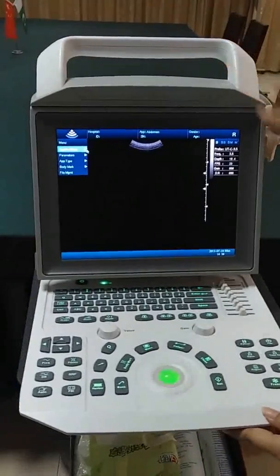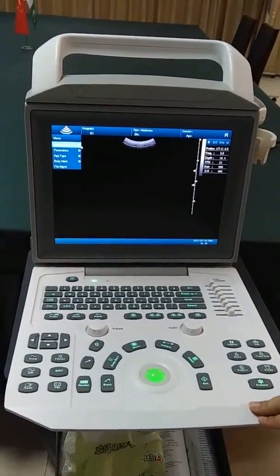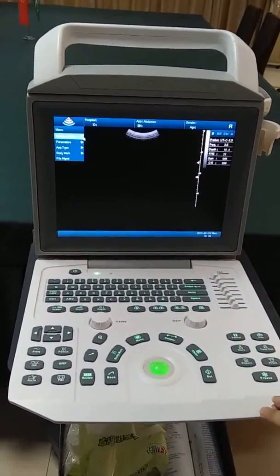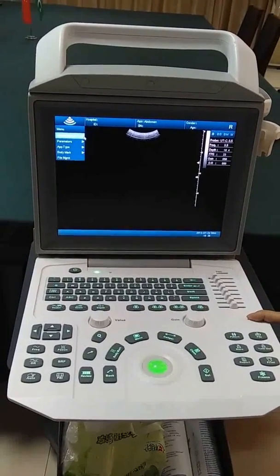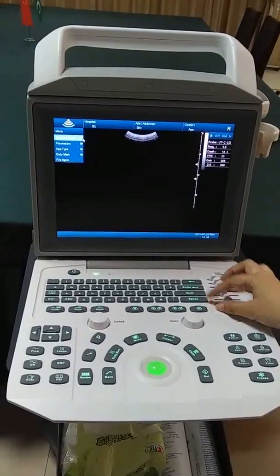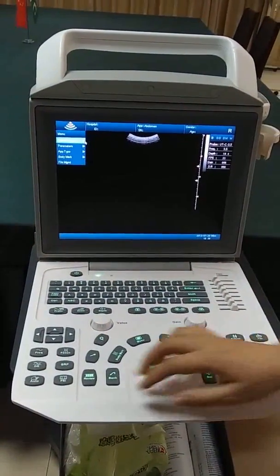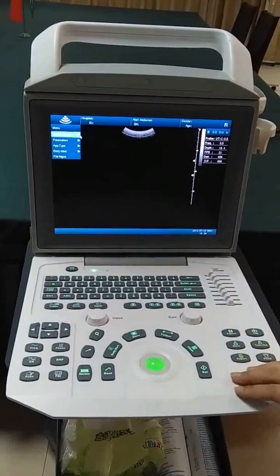You can see this is the control panel. It is divided into different areas according to function. This area is about patient information, this area is about image mode, this area is about parameter adjustment, and this area is about body mark, manual caliper, and so on.